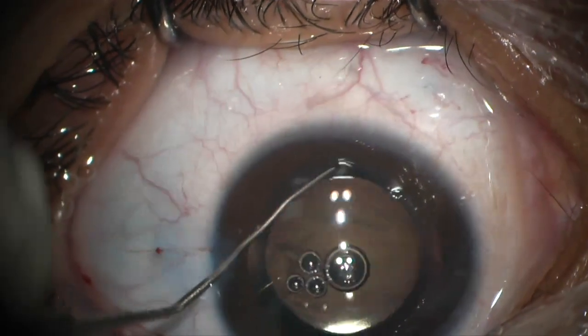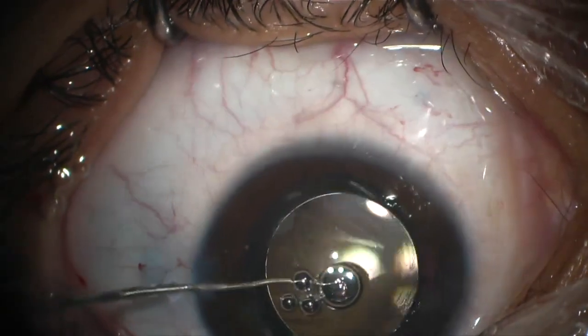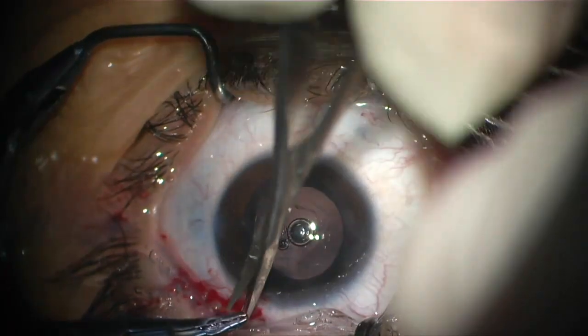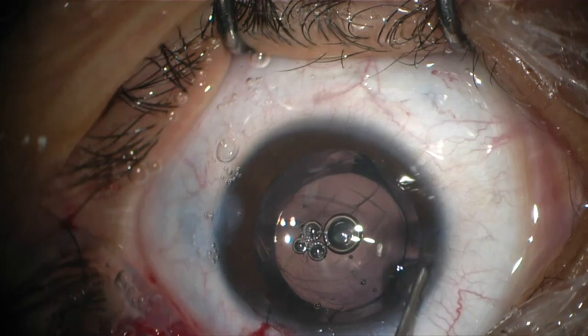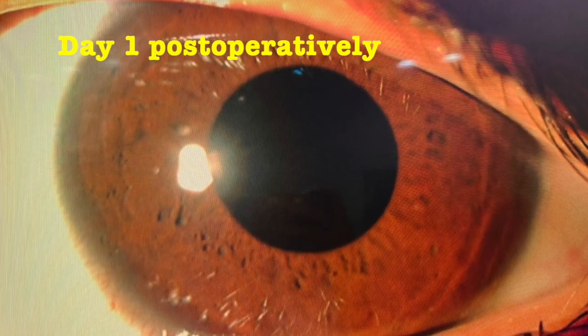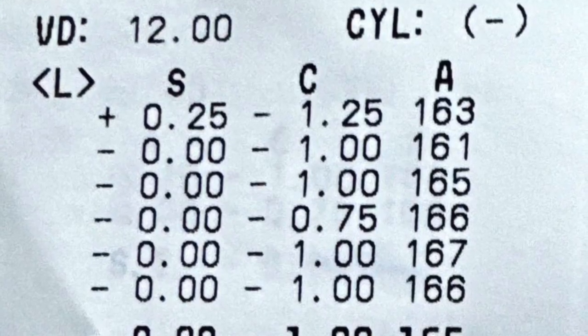A suture is taken and viscoelastic is left to pressurize the eye, followed by wound hydration. The next day, the child has a central IOL with a vision of 1.0 and 0.75 diopters of astigmatism.